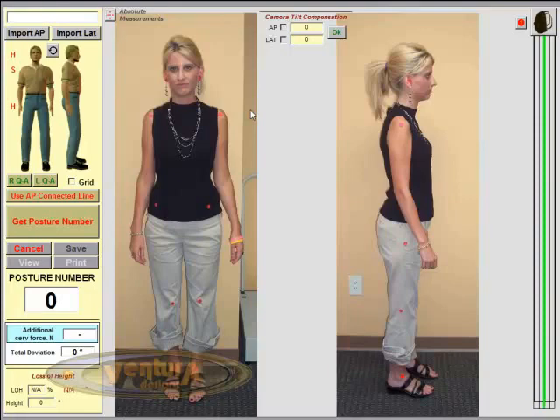But all I can tell you is that for the last 12 years, we have focused on posture correction with a set of embedded exercises and stretches inside Posture Pro, accessible from the main screen. And these stretches and exercises were developed by a PhD, John Chrisman.